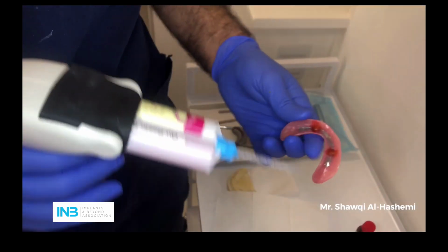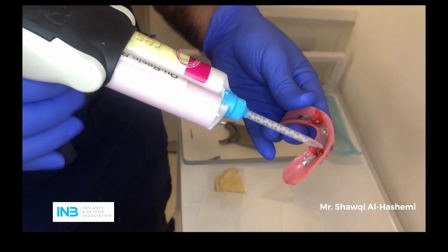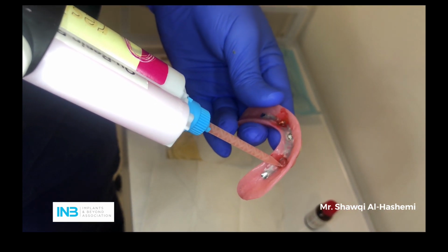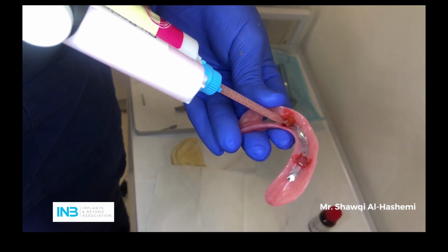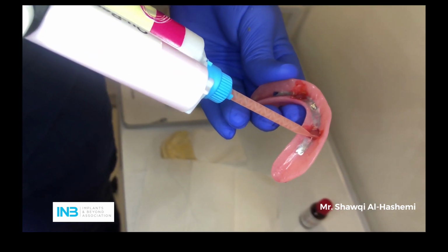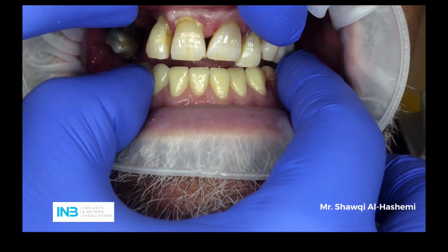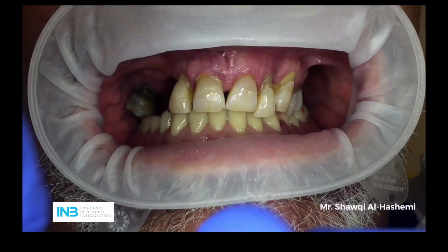Okay, good. Now once the adhesive has set, and you can see it's a bit sticky, the next thing to do is just apply your resin. Just go there and apply it there, and then the same thing on this side. Now I'm going to place it. And now that's engaged. Now bite on your back teeth. And that's it. We get a bit of excess acrylic where the hole is.